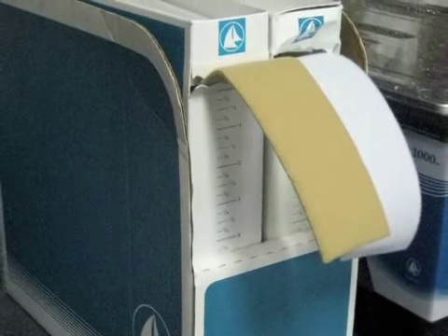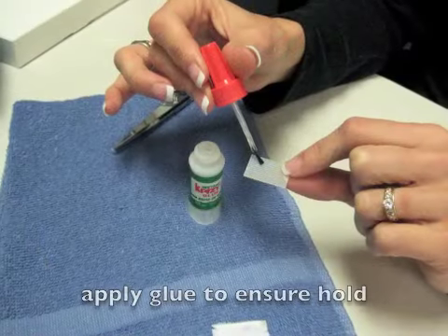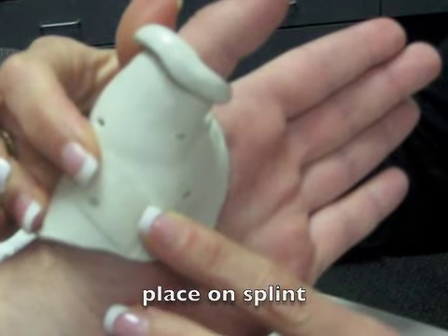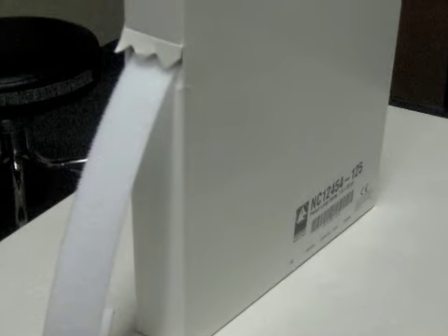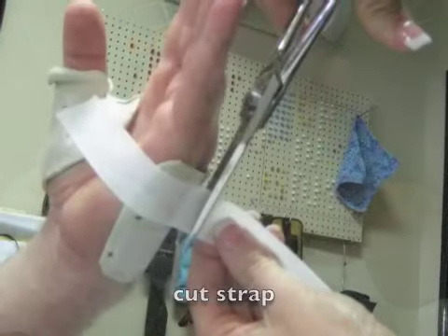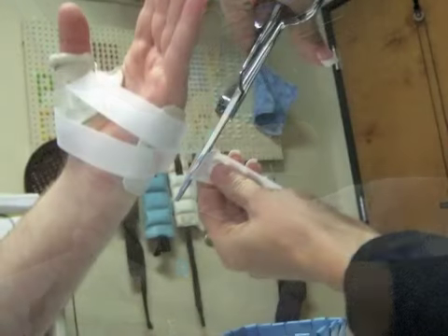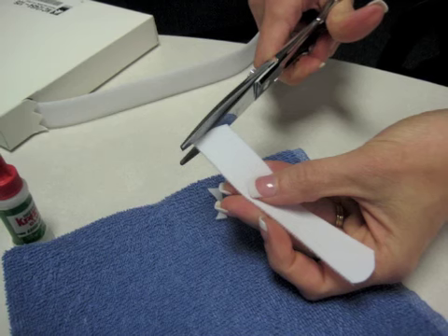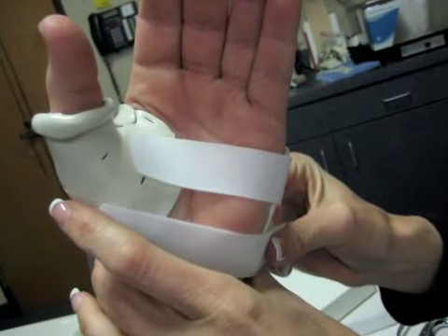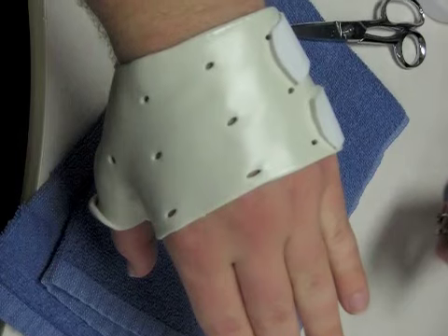Once the material has been molded, you are ready to attach straps. Cut small strips of hook velcro to be attached to the splint. Apply super glue to the strips as needed to ensure hold and place on the splint. Pull loop velcro strap from the roll but do not cut yet. Attach to hook velcro strips on both sides of the splint and then cut the appropriate length from the roll. Repeat this process for however many straps you need. Remove straps from the splint and round the edges so that there are no sharp corners. Place straps on the splint and ask the client if it is comfortable. Have the client perform radial and ulnar deviation and opposition and make sure that they still have functional use and it is comfortable.